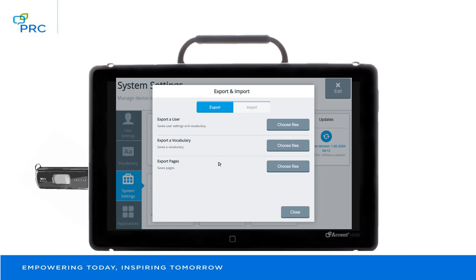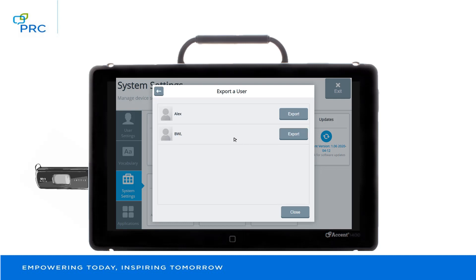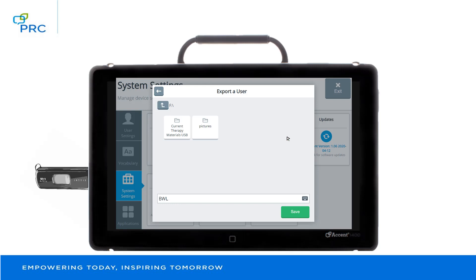For this demonstration, I'm going to export a user. I select Choose Files. I have two users in this device. I'm going to select the user that says BWL and then select Export. Now I can look at where I want to export that user. This is my flash drive right here. If I don't see my flash drive, I can arrow up and it will show me different files. I'm going to select the flash drive.